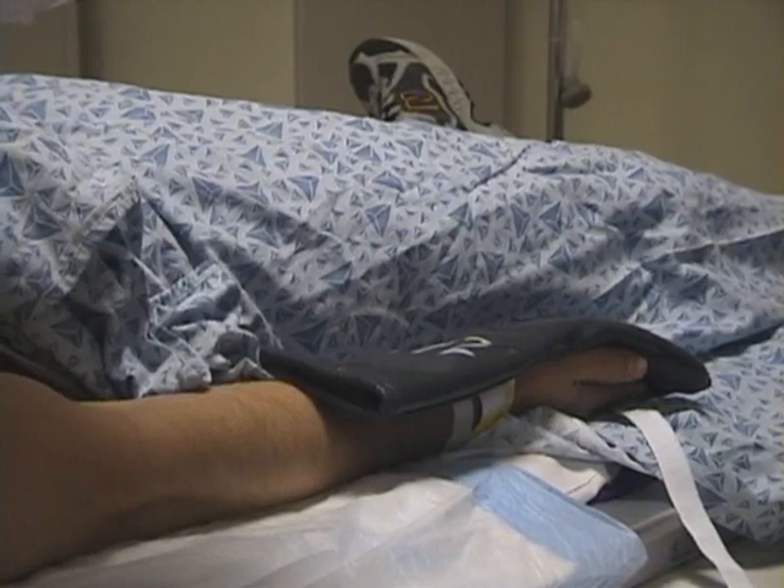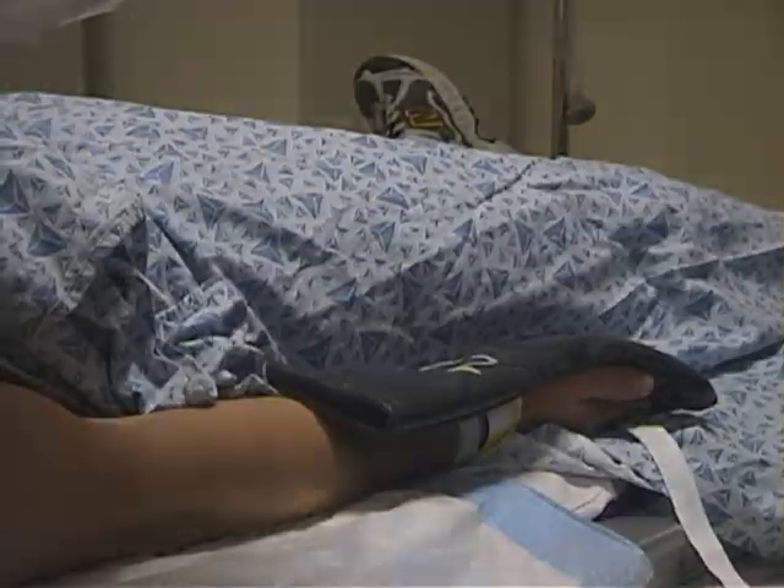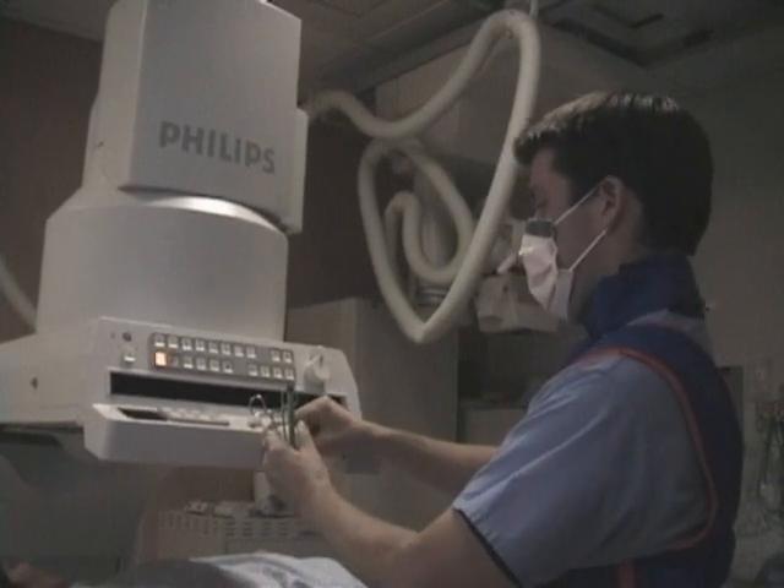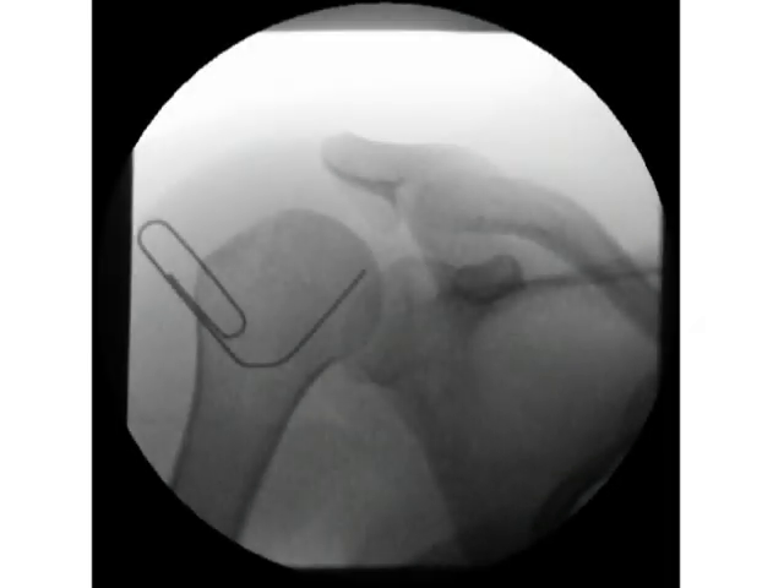For shoulder arthrograms, place the arm in external rotation. Mike and I both prefer the rotator interval technique. As you can see by the paper clip, this point is on the humeral head directly across from the coracoid process. That way, you avoid the glenoid labrum. You also avoid the biceps labral anchor.